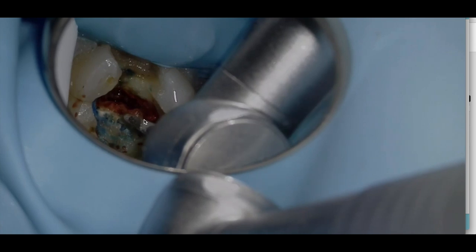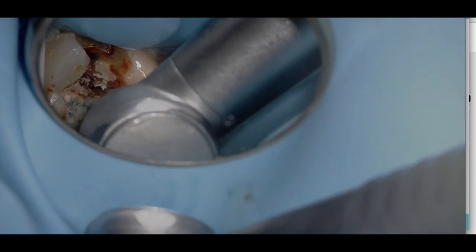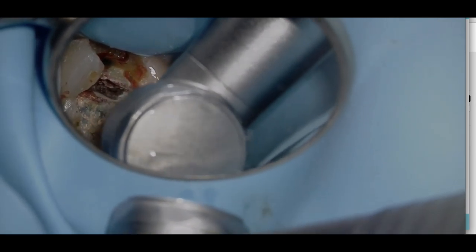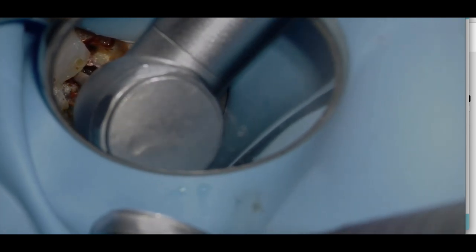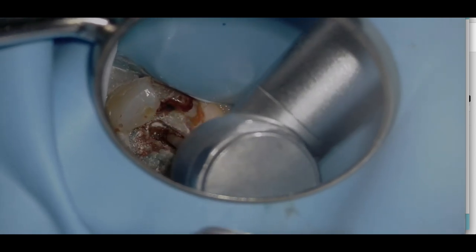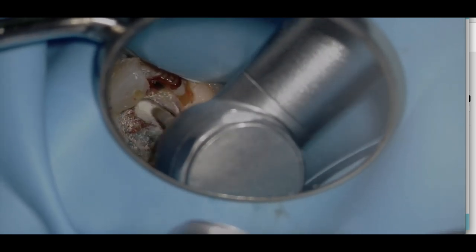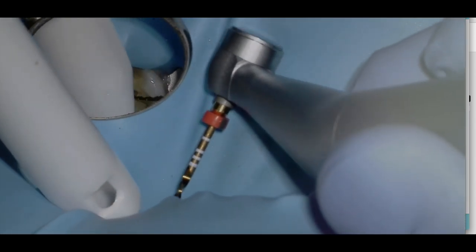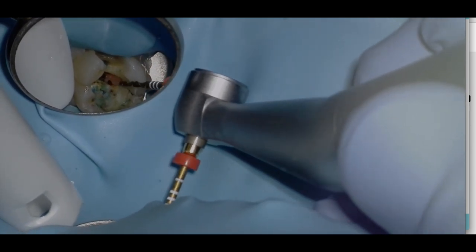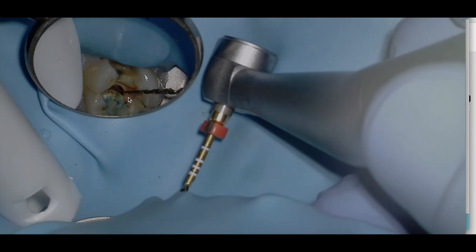I'm going to still try to keep this as conservative as possible, but we need to be able to clean and shape effectively. There are two ways you can do this - you can use an endozee burr, or I elected just to use a fine diamond. I'm not using any water, though you can. We've elected to do the pulpectomy in this case because she walked in with symptomatic irreversible pulpitis and symptomatic apical periodontitis. We didn't have enough time to do complete therapy, and we wanted to see if we get some resolution of her symptoms with just the pulpectomy before proceeding, because there's always a risk of the tooth failing because of that crack.